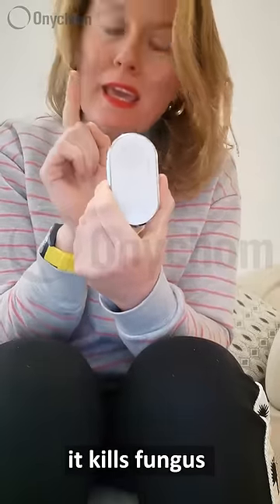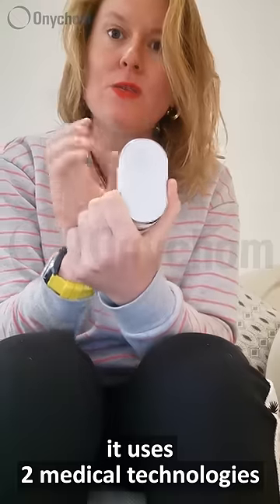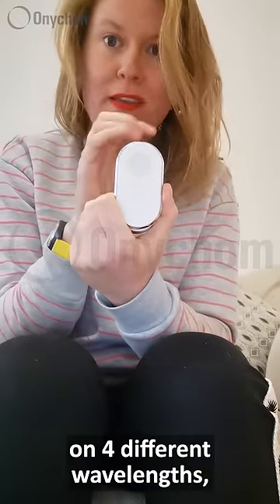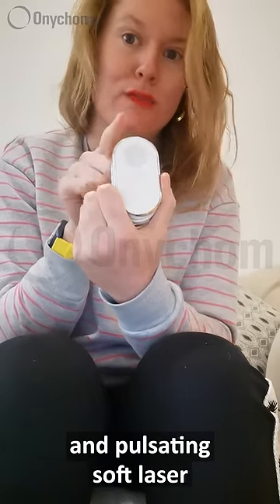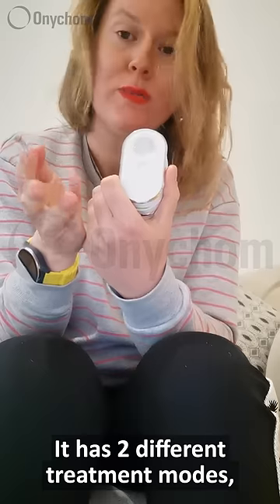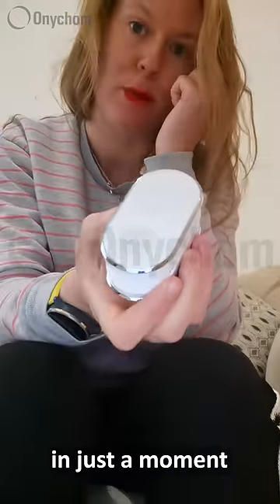It's an at-home laser treatment. It kills fungus without any pain or side effects. It uses two medical technologies on four different wavelengths. It has antimicrobial blue light and pulsating soft laser, so it has two different treatment modes. It's a premium design with a digital display right here, which you'll see in just a moment.